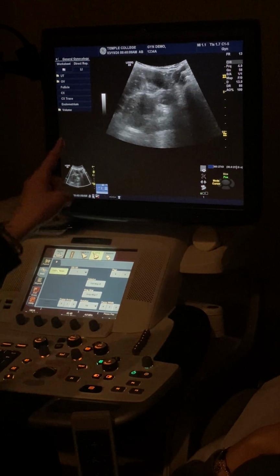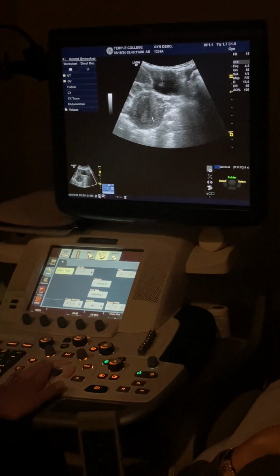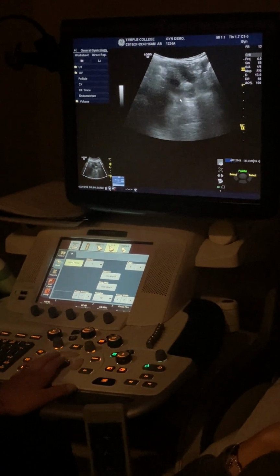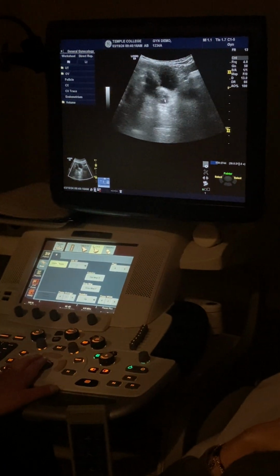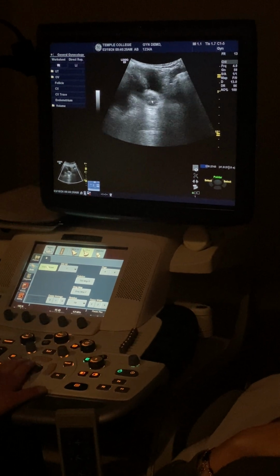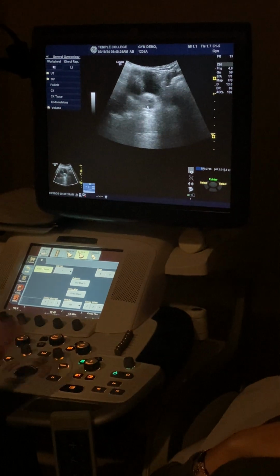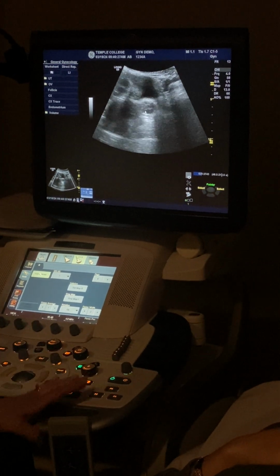See, as I'm coming up, did y'all see how it came off right there? Watch right here. I'm angling up towards the fundus. And then that's an ovary right here. Everybody see it? Follicles? We agree, ovary, yes? Yes. Now, is this long or is this trans?